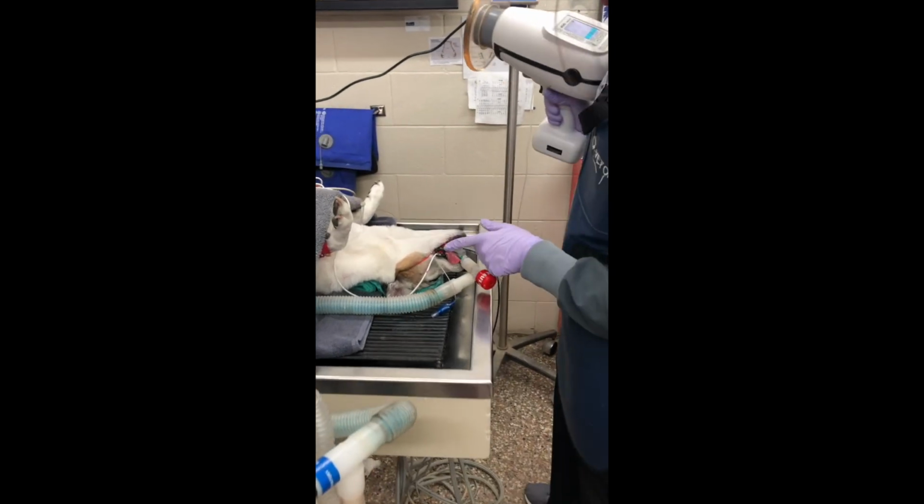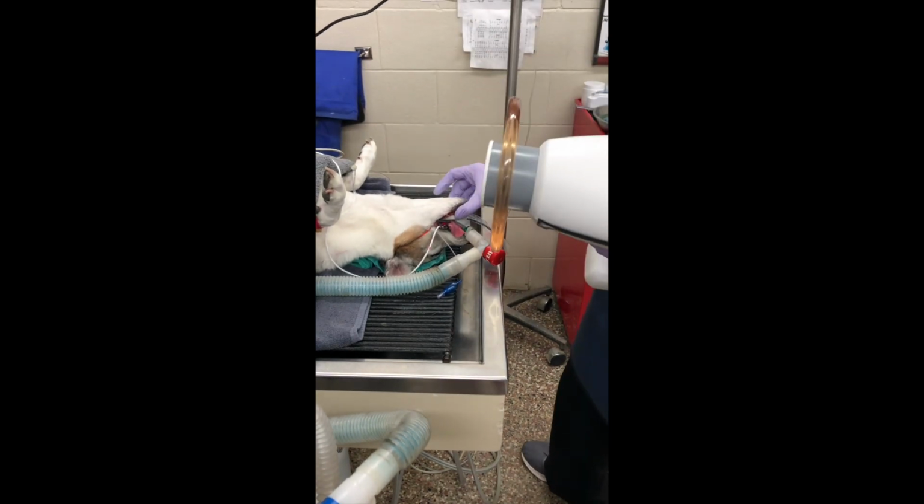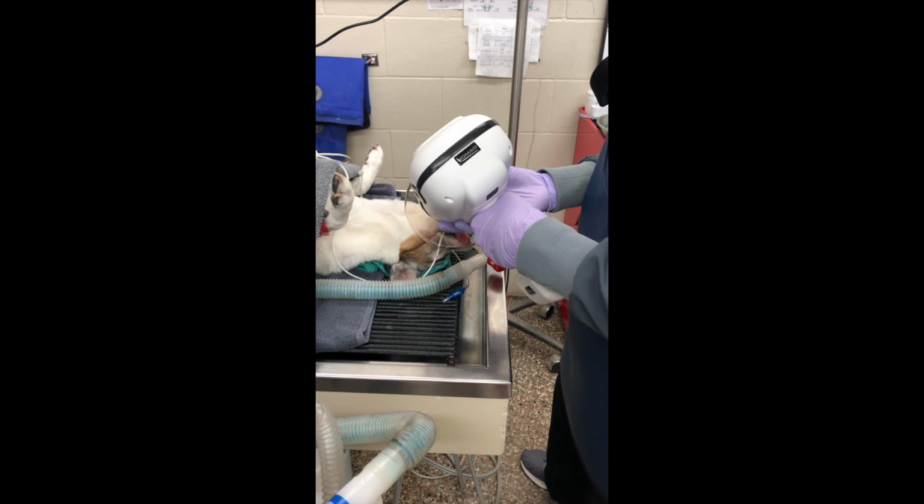Okay, now I'm going to get the premolars on the left side. So again, I have the flat side up, and I'm going to go at a 90-degree angle with the plate.